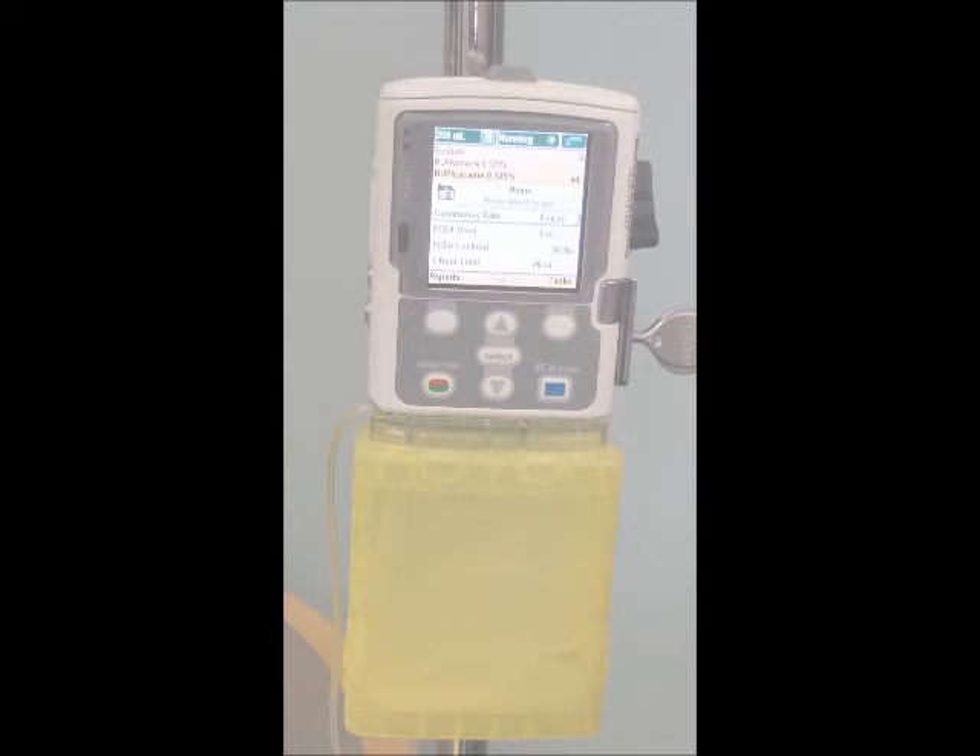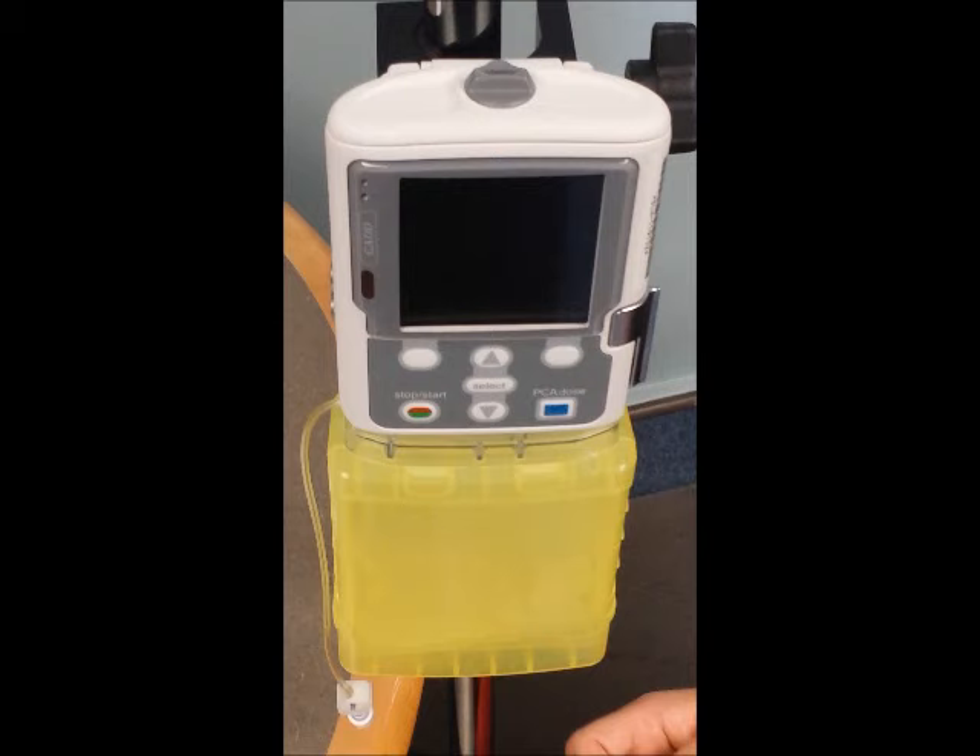When changing the cassette, you will scan the medication into EPIC and request your cosign.